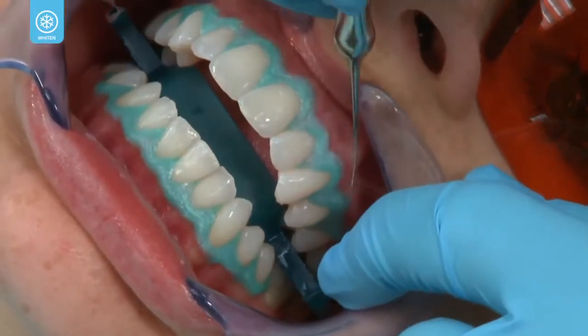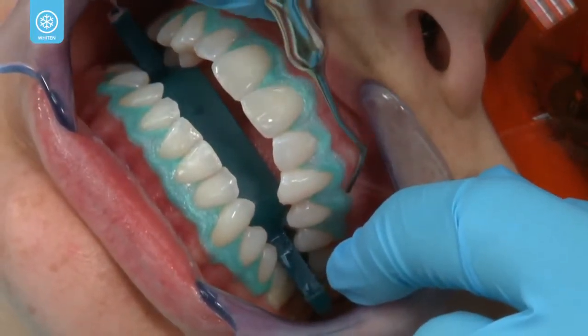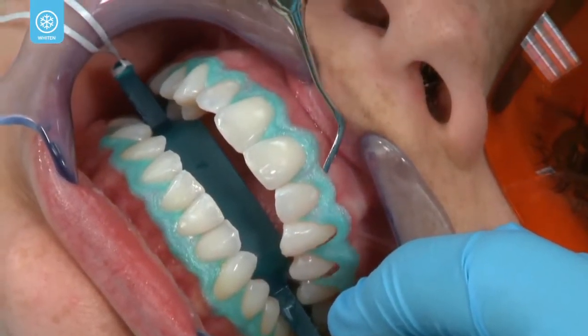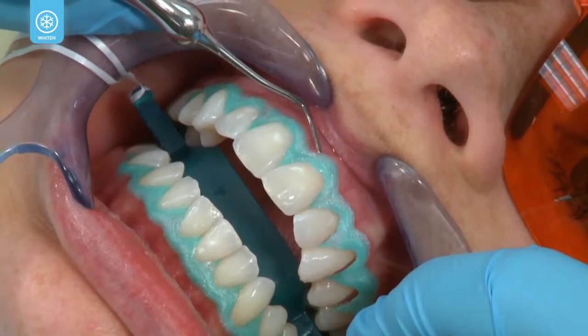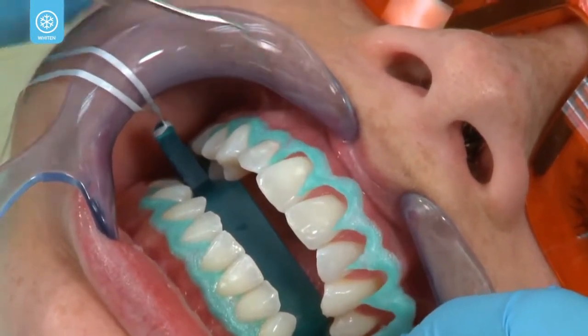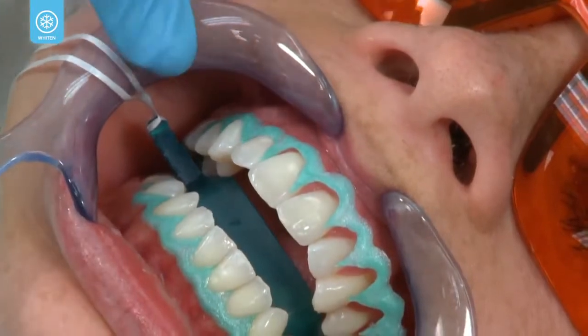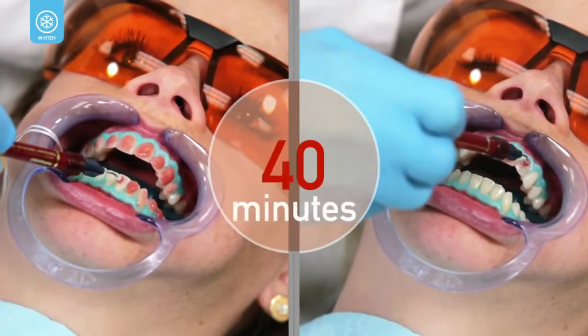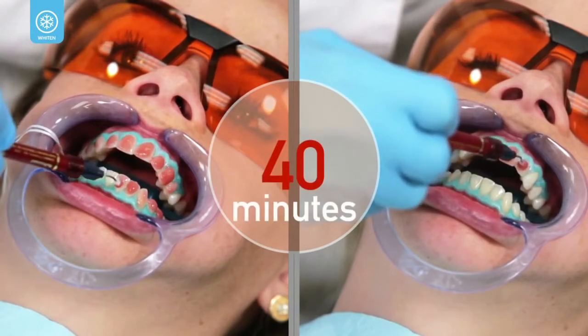Once the desired shade of white is achieved, use a dental instrument to remove the cured Opaldam resin barrier. It will easily come off in 1 or more large pieces. The total procedure, including setup and isolation, typically lasts 60 minutes. This includes 2 20-minute applications of Opalescence Boost for a total of 40 minutes of whitening time.